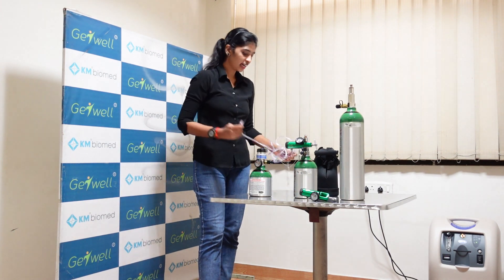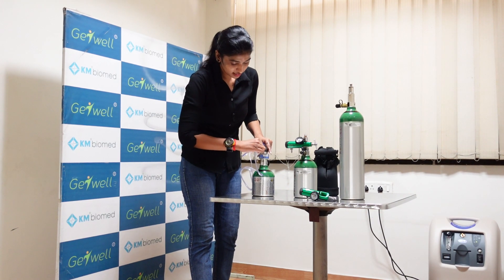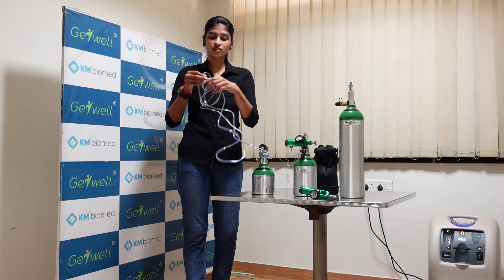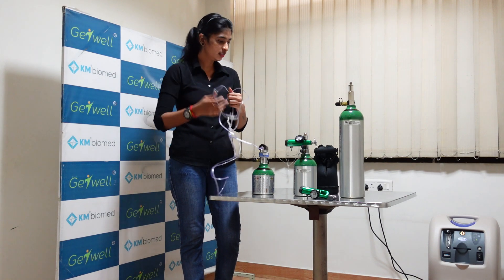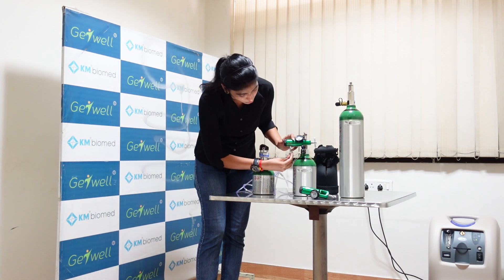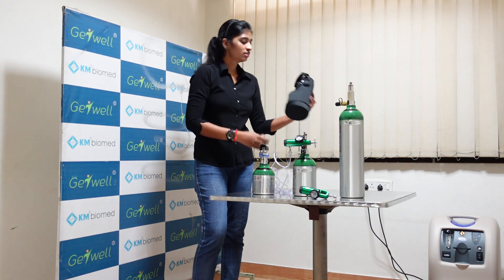This is the nasal cannula tube. On the conserver device you will have a nozzle — you can just insert it and then wear the prongs. You have to snug it in your nose and then you can use it. Similarly, on the other cylinder there is a nozzle on the humidifier — you just have to insert it, tighten it, and use it.